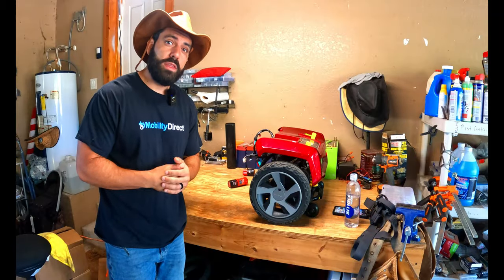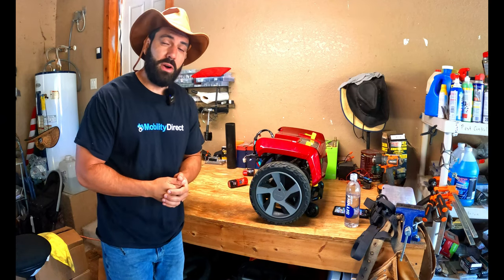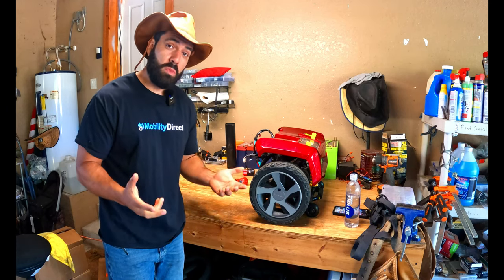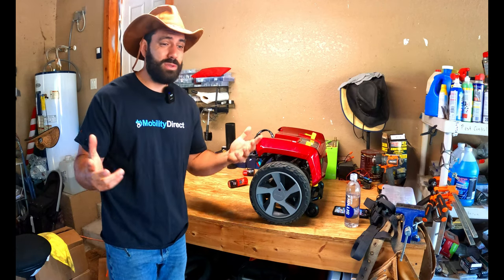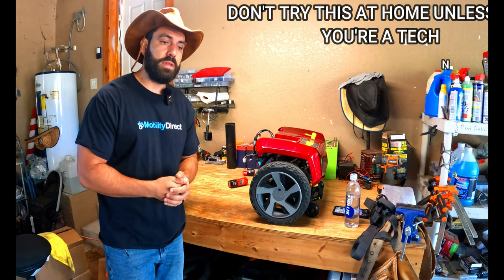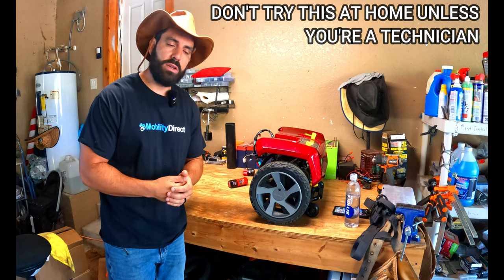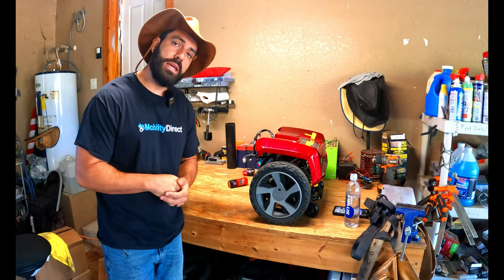With these extra features and extra components, the job gets a little bit harder when you have to do repairs. They're great products, but with more features, fancy electronics, and gadgets, more things are prone to breaking. This is intended for technicians — don't try this at home. If you're not a technician, it could void your warranty.